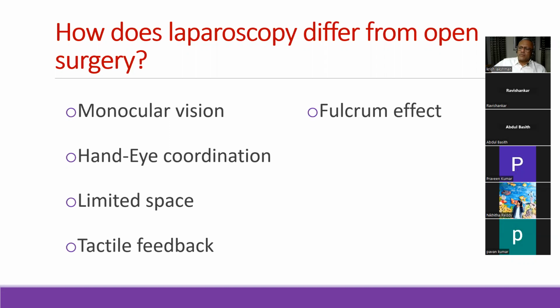And the amplification, sir. If you move a little, it moves a lot. Always? When does that happen? You're right, but when does it happen? The segment of the instrument inside the abdomen must be longer than the segment outside the abdomen. That's when a shorter movement of the handle, which is outside the abdomen, will increase the movement or the swing of the tip of the instrument.